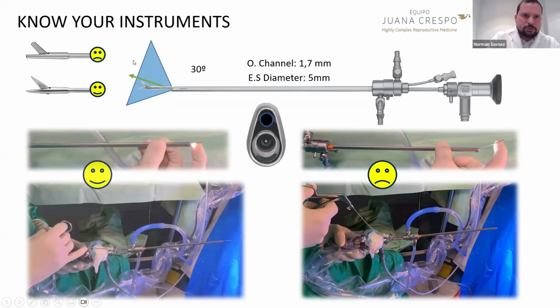So I recommend to align the axis of the scissors, as you can see here, and also in this superior part of the slide. You can align with the working channel, and doing it this way we can protect the scissors from breakage.